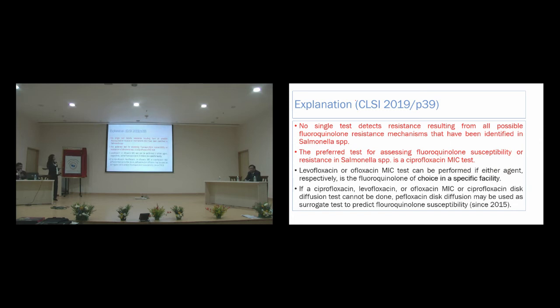Actually speaking, no single test detects all resistance mechanisms for fluoroquinolone in Salmonella. There is no single test, but the most preferred test is the ciprofloxacin MIC test. In centers where they use levofloxacin or ofloxacin as a clinical choice, they can do the MIC test of levofloxacin or ofloxacin. If ciprofloxacin, levofloxacin or ofloxacin MIC cannot be done, in such a situation pefloxacin disc diffusion may be used as a surrogate test to predict sensitivity to fluoroquinolones. The most preferred one is the ciprofloxacin MIC test, and the respective MICs should be done by those laboratories.